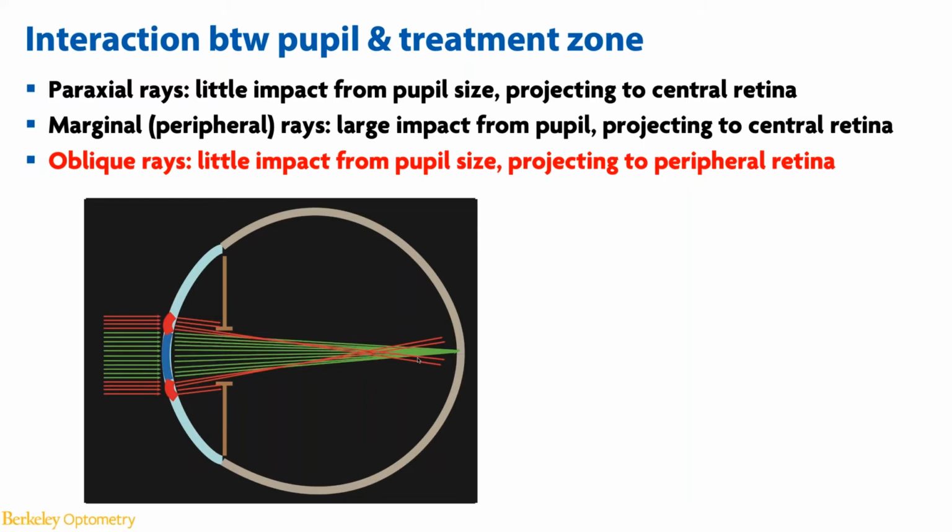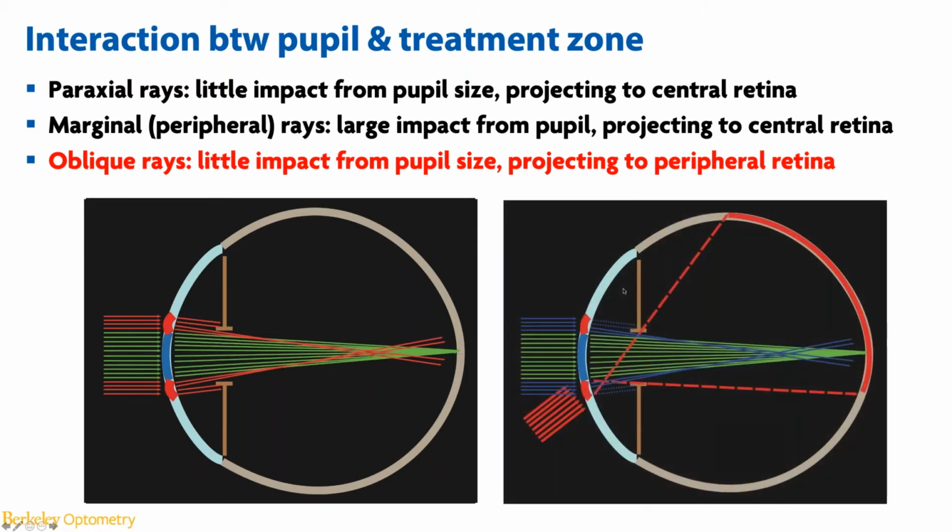And so this type of rays gets a lot of input from the paracentral steepening, and the pupil size plays a huge role in limiting or allowing how much of the peripheral rays are getting into the visual system. But because the incidence angle is 0, so it's parallel to the optic axis, it's still mostly affecting the image quality of the central area of the retina. The third type of rays, again, on the right side showing in red, is the oblique rays.